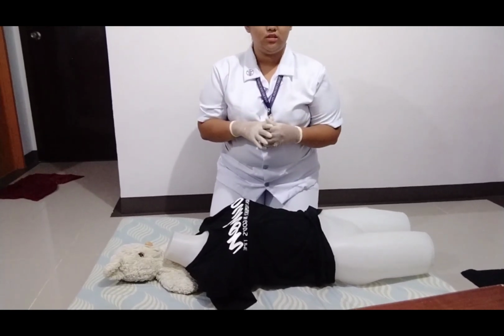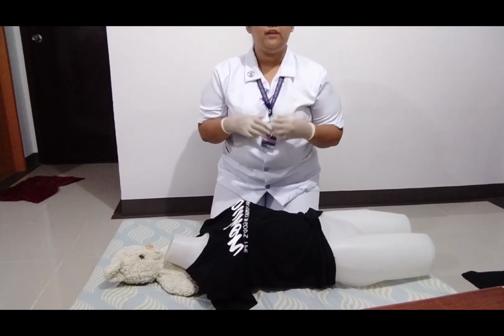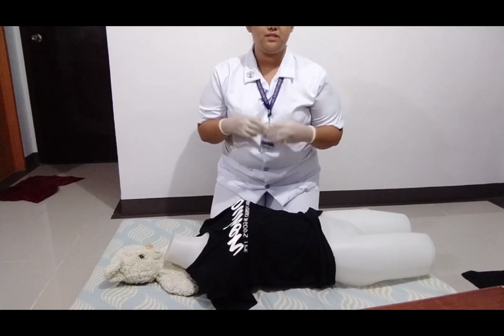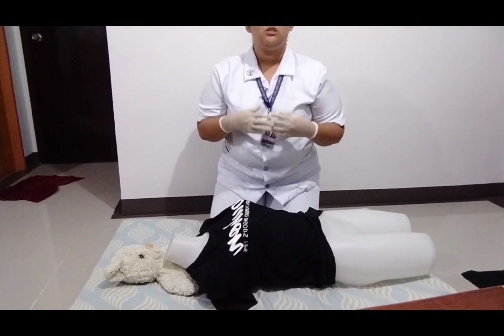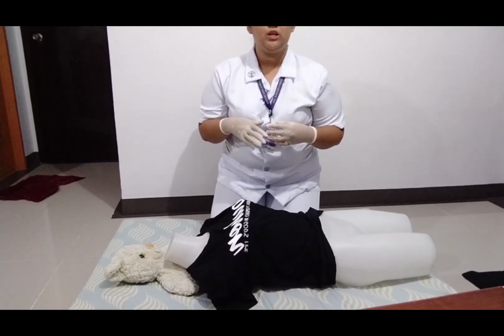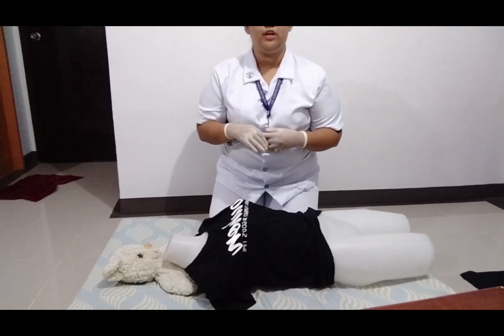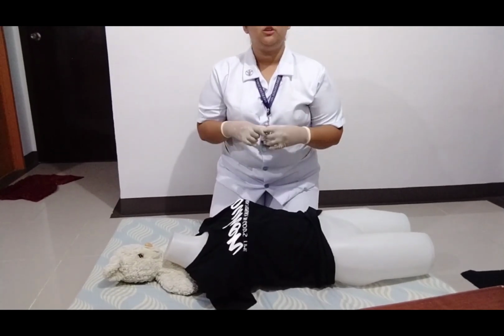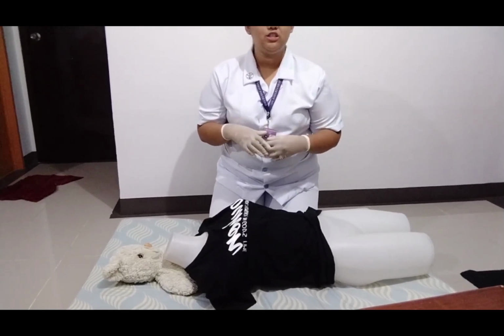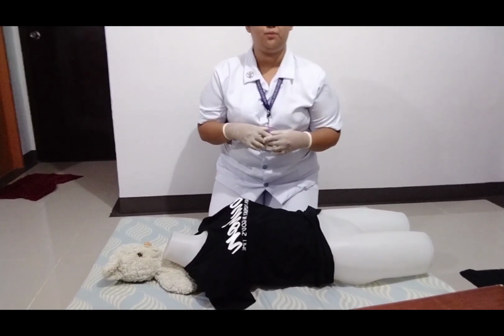Now, doing 30 chest compressions and rescue breathing while waiting can be very exhausting, and if we do get exhausted, our compressions become less and less effective. So in order to avoid that, we'll have to ask a bystander who is easily taught how to do CPR, or someone who already knows how to do CPR, so that we could have someone to switch roles with when we get tired, so that we'll have enough time to regain our strength and maintain high quality chest compressions.